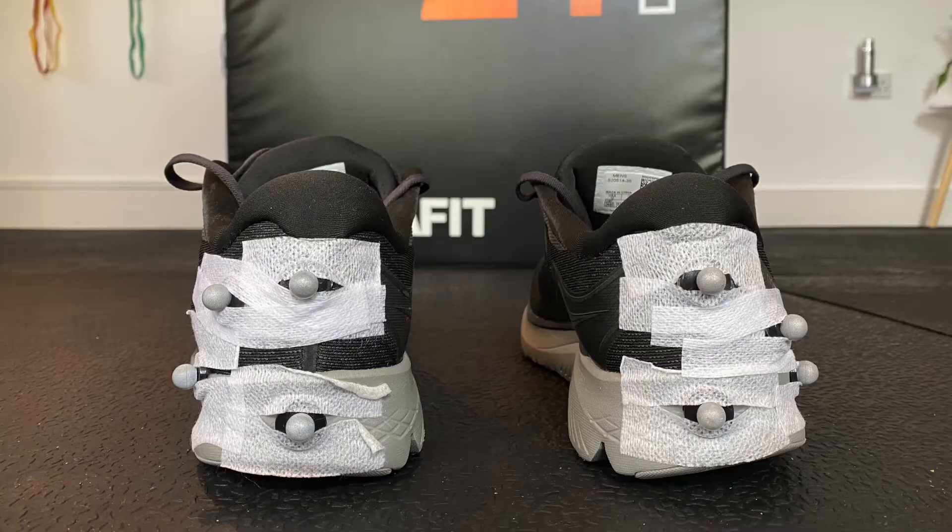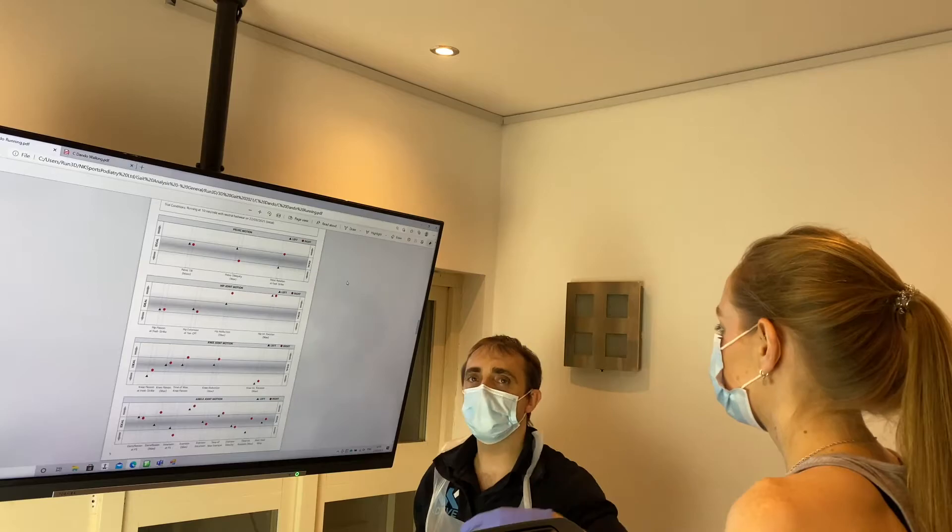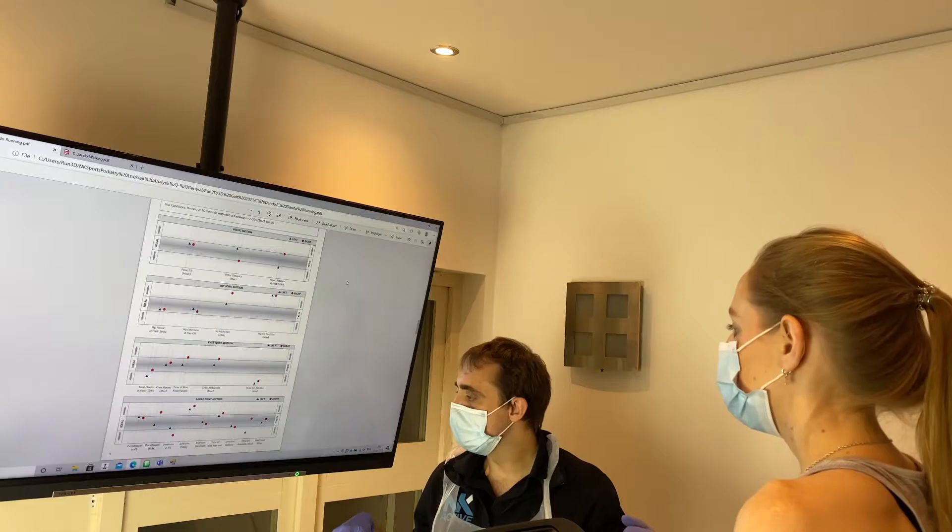We also test everyone in the same set of shoes, because the markers are stuck to the shoes — we're measuring what the shoe is doing, not the foot. By testing in the same shoe, we know that the effects we're seeing aren't related to footwear.